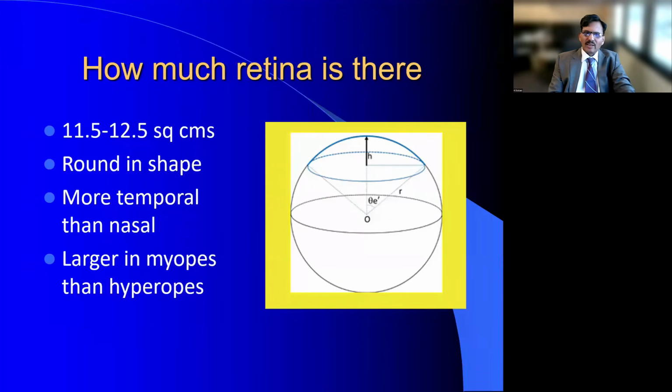And we're really talking about the first 12 millimeters, then no retina. So the next 24 millimeters, you have retina. And the most difficult to visualize is the area between 12 and 18 millimeters. That is in front of the equatorial region because of the spherical shape. Since we're viewing the retina from the pupil, the back surface of the 18 millimeters is relatively easy to visualize up to the equator, marked by the vortex veins. But the 6 millimeters of retina that is in front of it to ora serrata is the difficult one because of the spherical shape and its related aberrations.